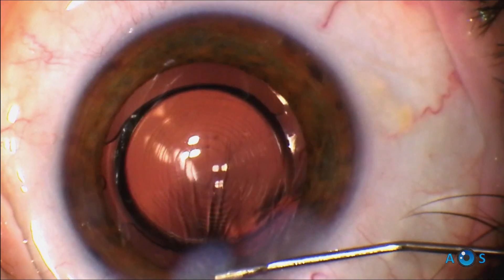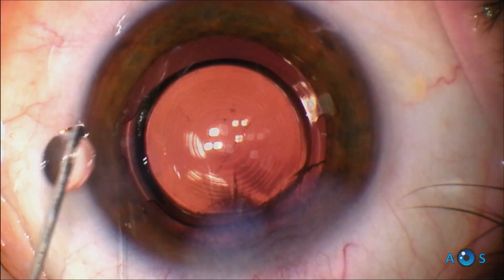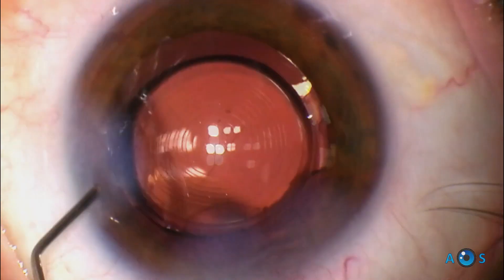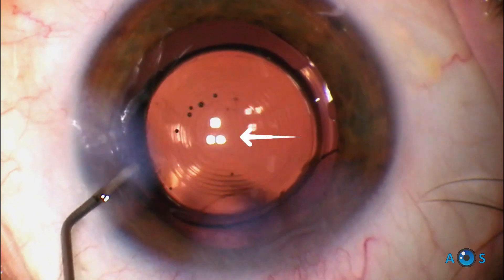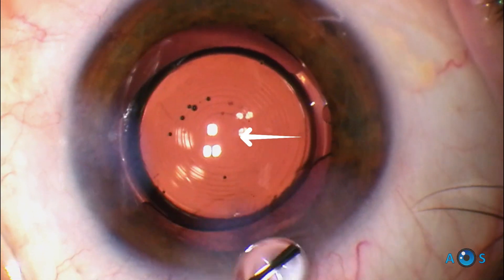This is important in trifocal lenses, in which obtaining optimum centration of the inner diffractive ring with the visual axis is fundamental. This lens is also available for toric corrections, and we find it to be very stable and precise.